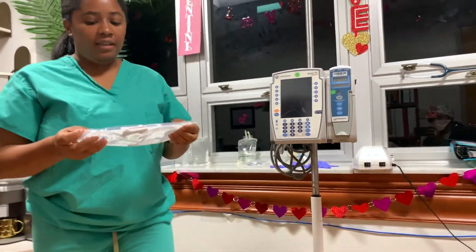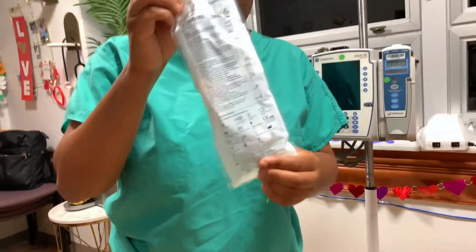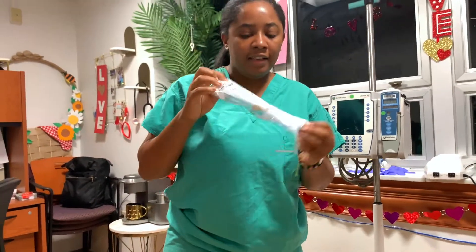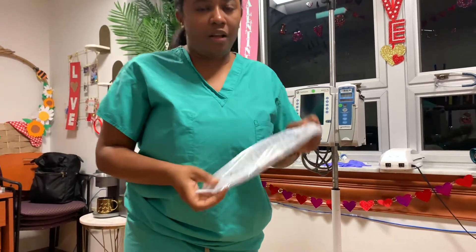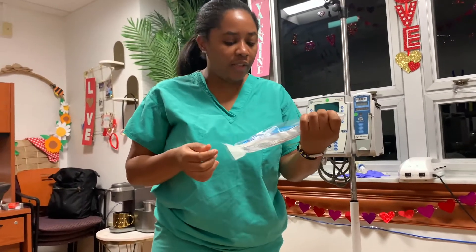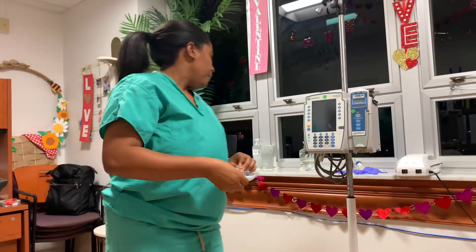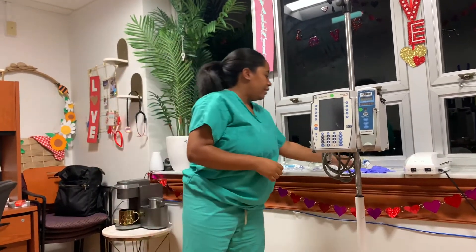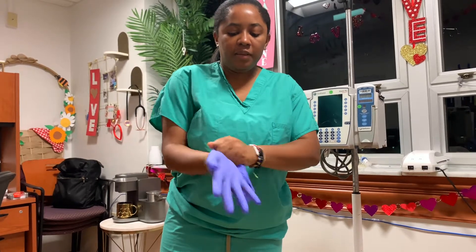What I am going to need is my primary line. Before we open anything, you always want to make sure that you're checking expiration dates on all of your packages, just to make sure that everything is good, not open, and the integrity is good. Of course with any procedure you want to make sure that you wash your hands. I already reviewed the medication that I am going to be administering to my patient. Go ahead and put on some gloves.